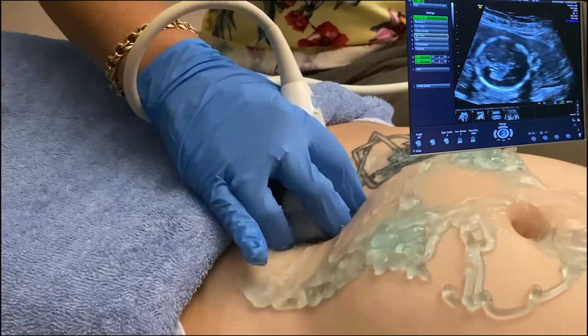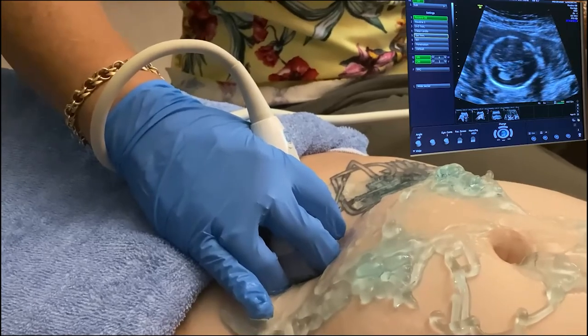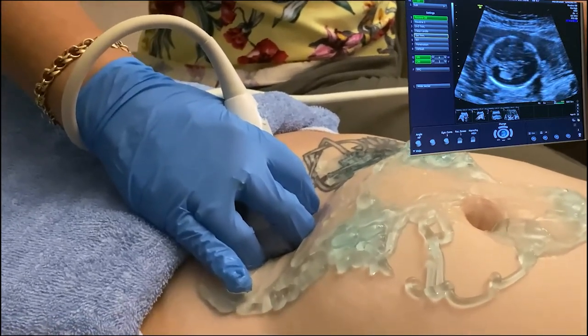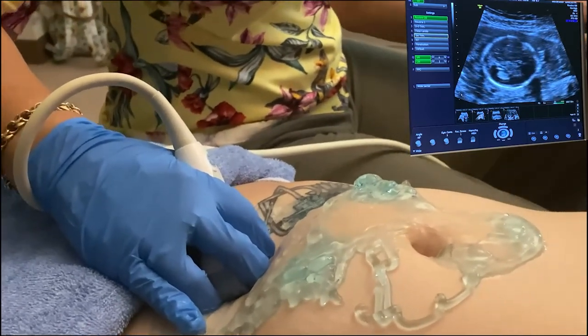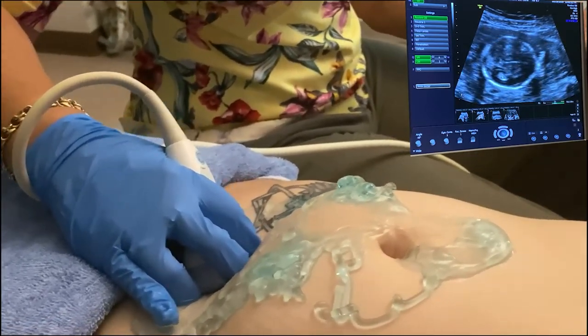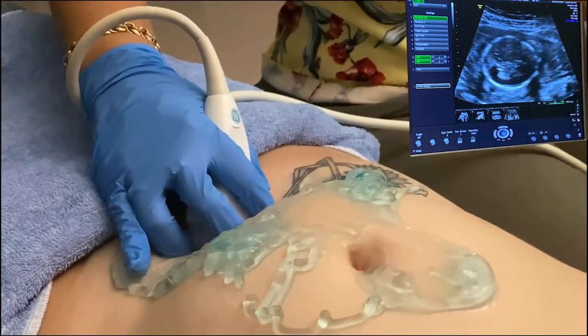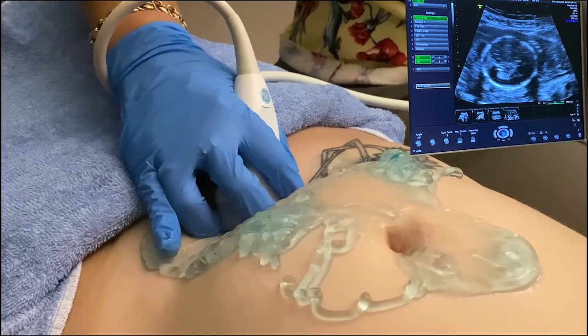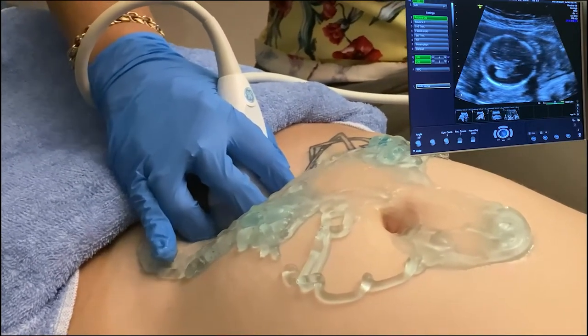We can see what you would be on the lookout for if it was too big. Since the choroid is gravity dependent, even though babies are in somewhat zero gravity, within that ventricle we would see it dilated, and the choroid, which is the hyperechoic area within the ventricle where cerebral spinal fluid is made, becomes dependent, and we would actually see it dangling inside the ventricle.